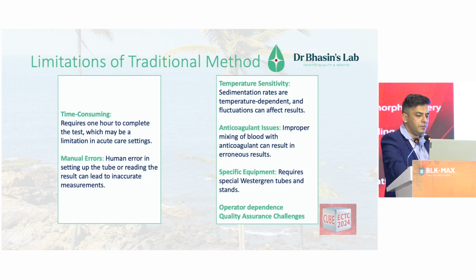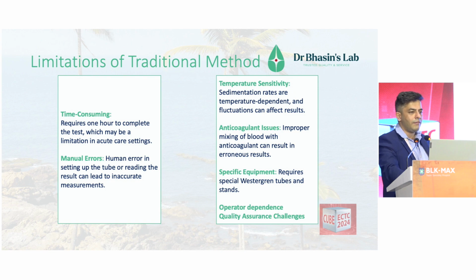Temperature sensitivity, sedimentation rates are very sensitive to temperature. And when we are looking at results, we are not just looking at results coming from our lab. We have to answer to the clinicians. Say Pankaj sir was here, he's talking about Palwal. In Delhi, I don't have neighborhood of such labs, but in a place like Palwal, he would have a lot of unregulated labs run by technicians in one room, who would have an AC to probably run their CBC analyzer, but for ESR, they will never turn it on.